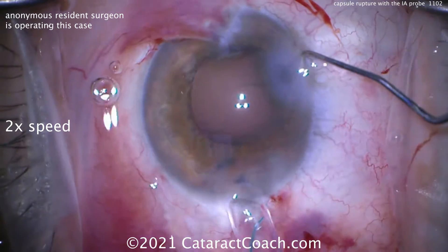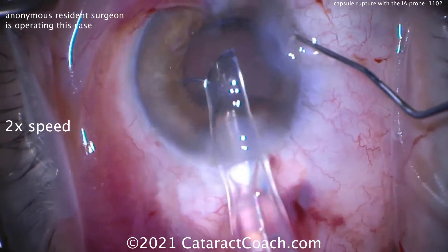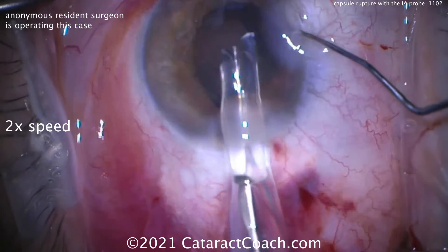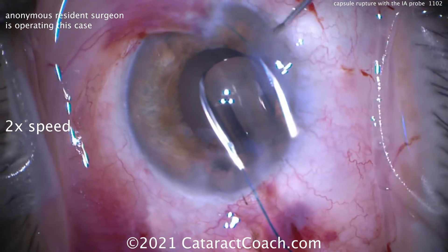Let's get the lens in — a three-piece lens. We're going to put the haptics in the sulcus and the optic; we're going to capture that behind the capsulorhexis. So let's deliver the lens. Remember, it comes out like the first haptic like a 7. There it is. And then the second haptic, the trailing one, like the capital letter L. Notice how the entire lens is being delivered on top of the iris.